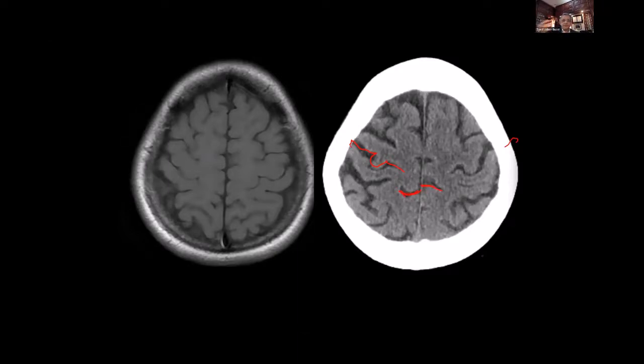Every brain is a little different, and here is the precentral sulcus, dividing the central sulcus. You see this knob sign again here, omega sign, hand knob sign, right, and the superior frontal sulcus joining the precentral sulcus in here. In this one, this is the superior frontal sulcus joining the precentral sulcus, and then this looks like the central sulcus, and this looks like the pars marginalis over here. Same thing: superior frontal sulcus, precentral sulcus, central sulcus. Here it is dividing a little bit.